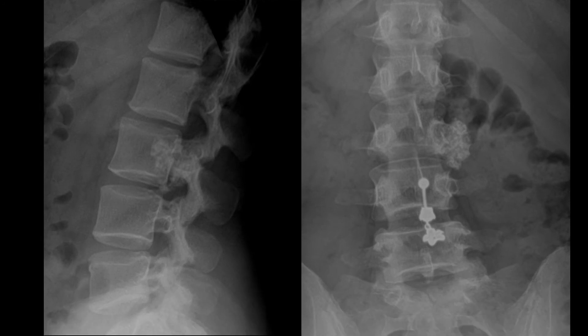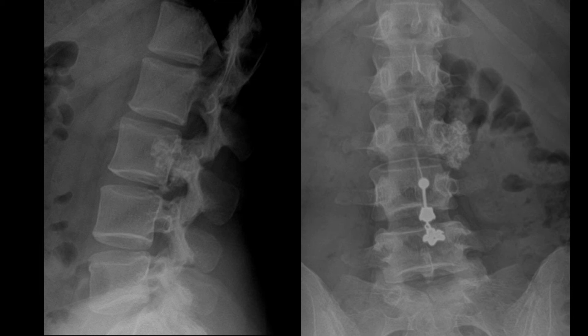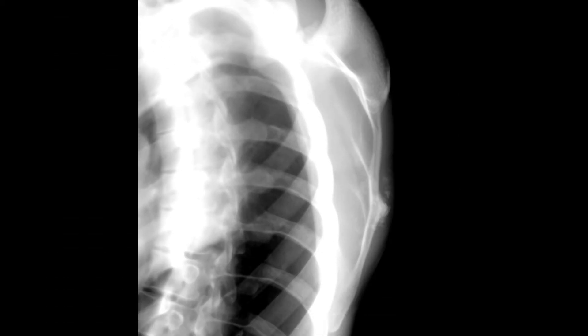This 27-year-old patient presented with neurologic symptoms and radiculopathy. On the frontal and lateral lumbar radiographs, there is a large expansile lesion projecting off the posterior elements at the L3 vertebral body — a spinal osteochondroma. Due to its location, these can be more symptomatic, affecting the adjacent spinal canal and exiting nerve roots, and have a higher chance of being surgically removed. This patient did undergo surgical removal.